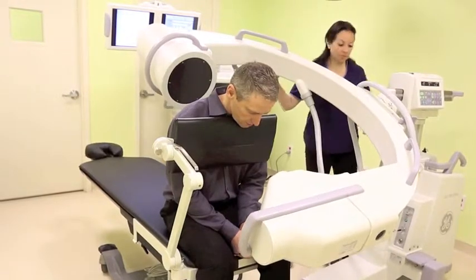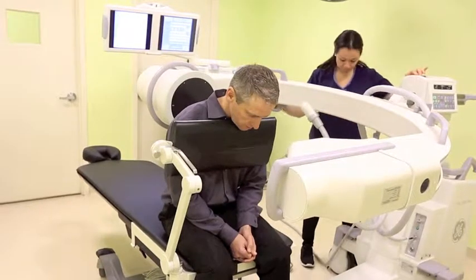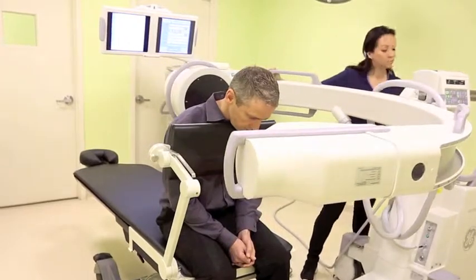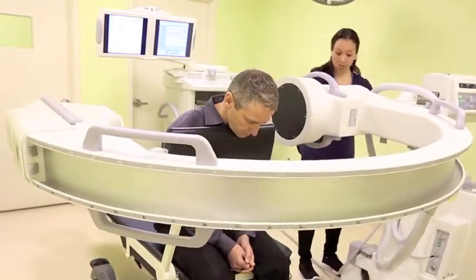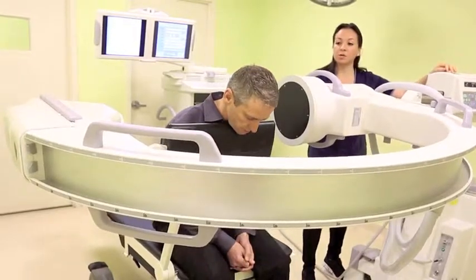And from the A-P position, you go to the lateral. Again, you adjust it, depending on which level you want to go.